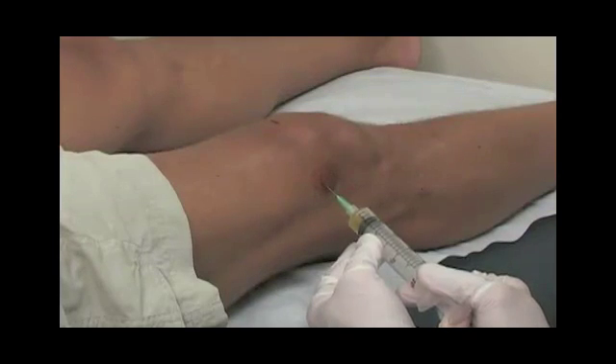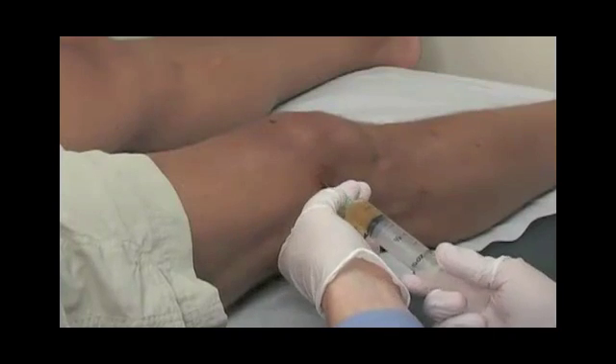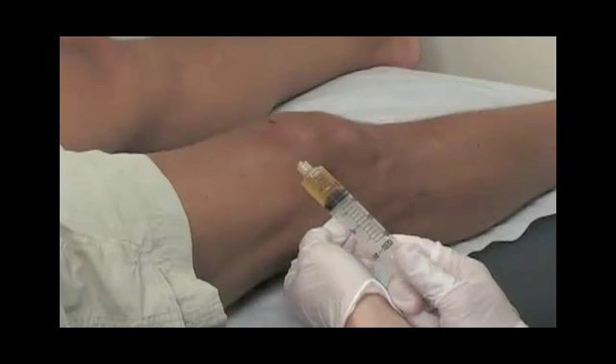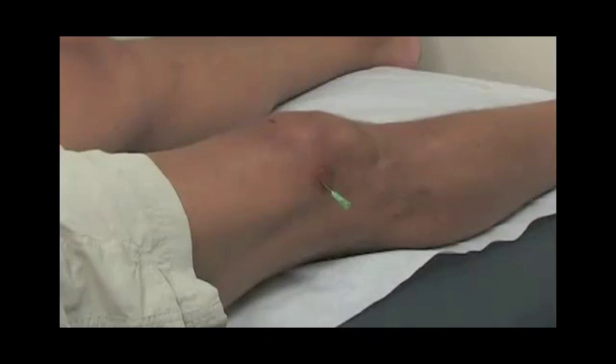Once fluid is aspirated, or simply just a flashback of fluid within the barrel of the needle, we'll place the Synvisc-One syringe on the needle.